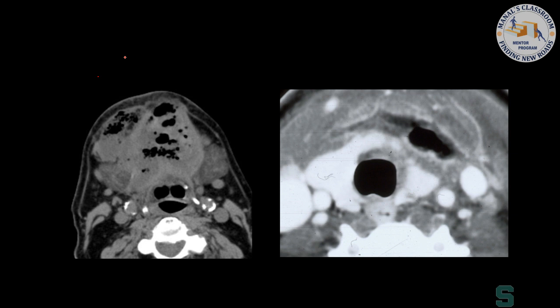Now, here's another disease that can present in the middle of the night. In order to make this diagnosis, there's some history that you have to ask me. Has the patient ever been treated with chemotherapy or radiation therapy? The answer is no, and I'll explain why. Has the patient been involved in a motor vehicle accident? No. Has the patient been coughing a lot? No. Has the patient had recent surgery? No. So what's the history? The patient's presenting with a severe, severe infection.